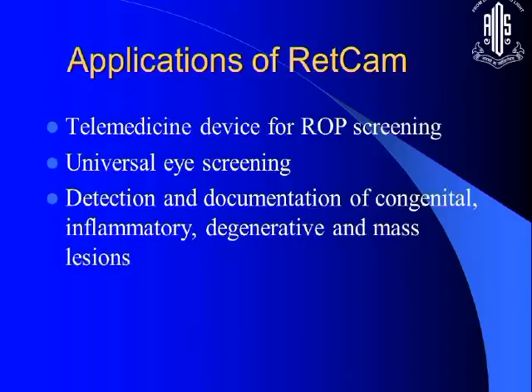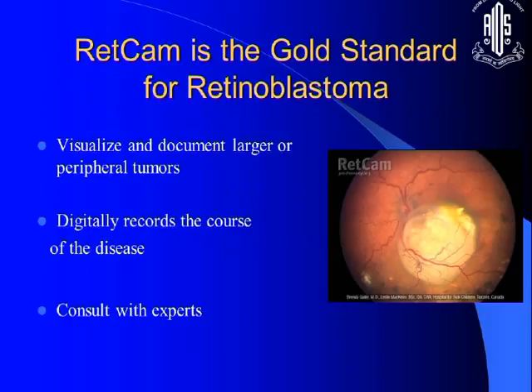Most clinics that have a busy retinoblastoma service have this tool. And here you can again have digital records. You can document the progression as well as the regression.